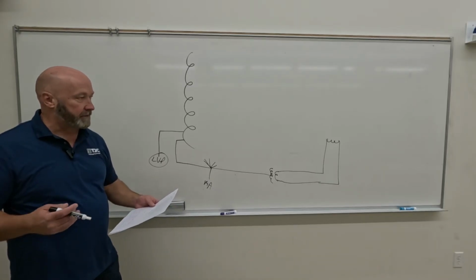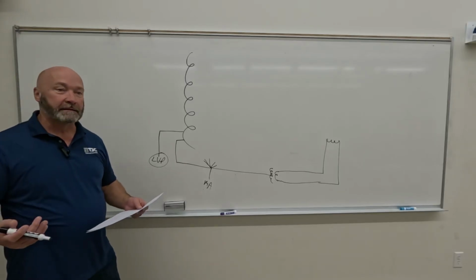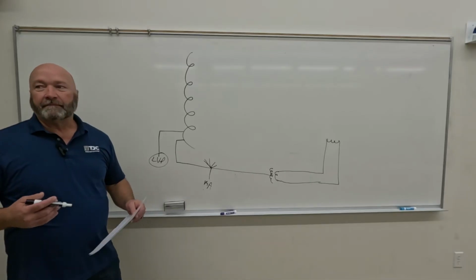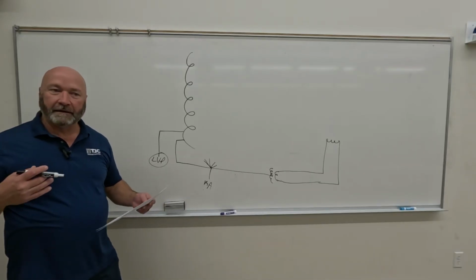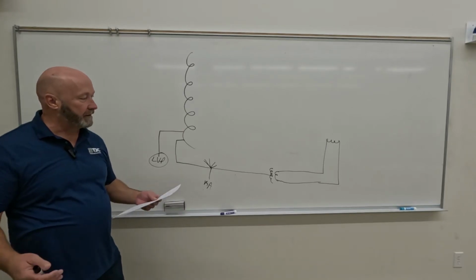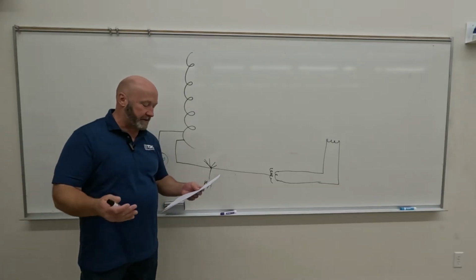The space charge effect was to make sure that we send just the number of electrons across the tube that we wanted during exposure, as opposed to saturation current, which is the maximum tube current, the maximum tube limit, so the greatest mass that you can send across.